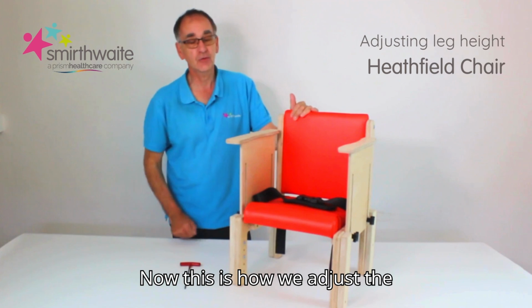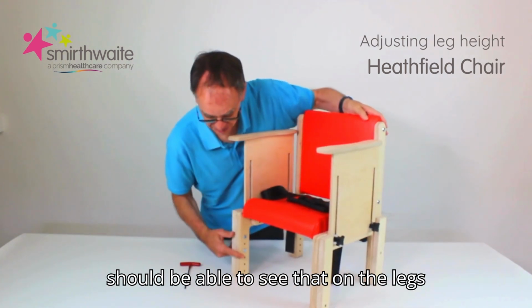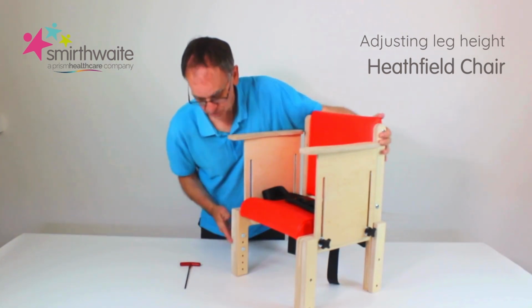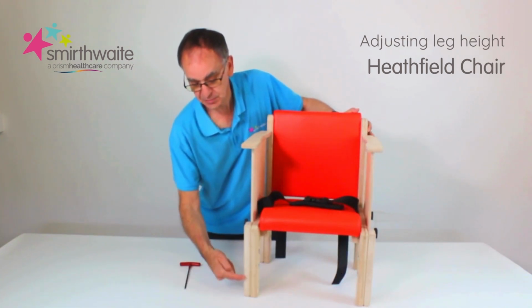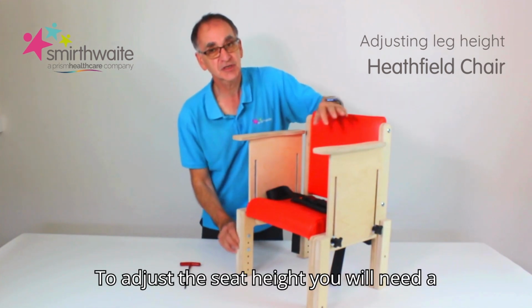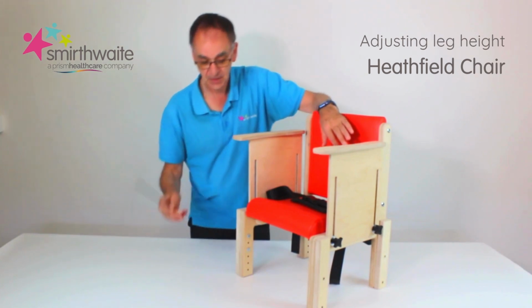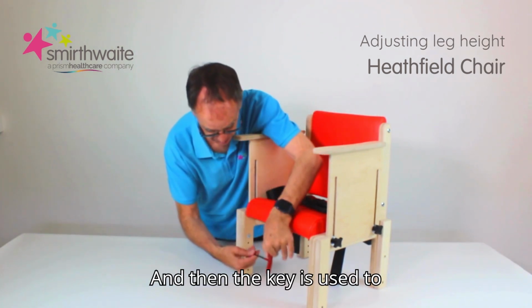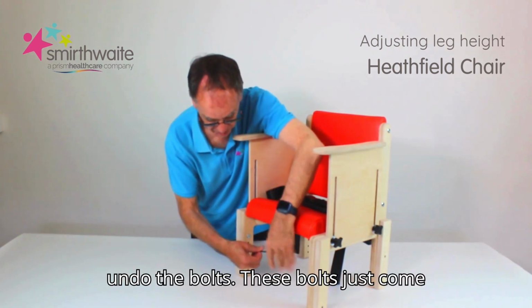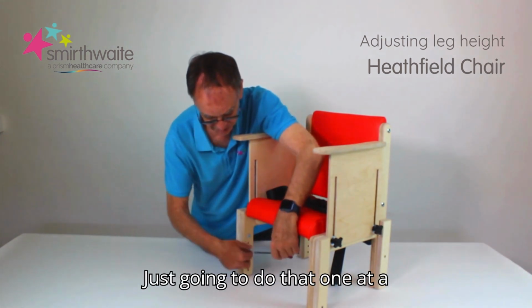Now, this is how we adjust the legs. You may be able to see, or you should be able to see, that on the legs there are two bolts which hold what we call outriggers, this piece here on the outside of the leg. To adjust the seat height, you will need a 4mm Allen key, and then the key is used to undo the bolts. These bolts just come out. They should come out quite easily. I'm just going to do that one at a time.